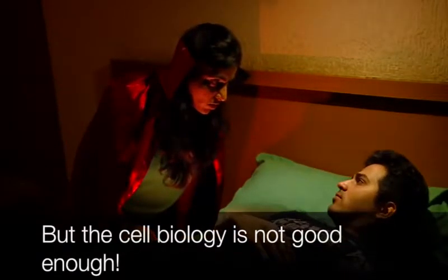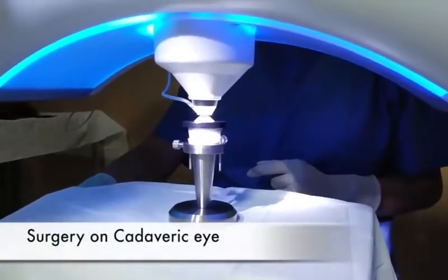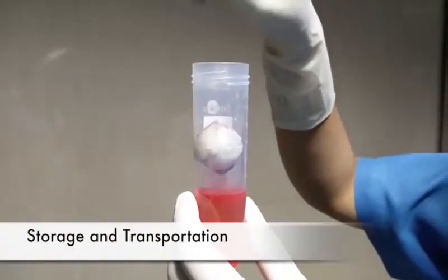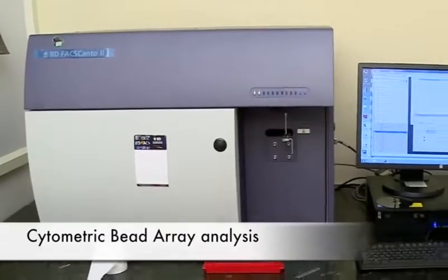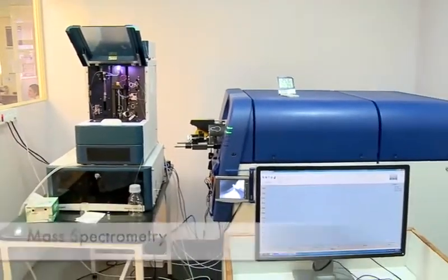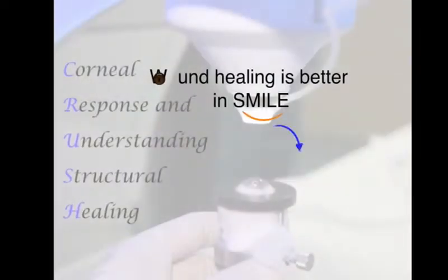The cell biology is not good enough — I am still not convinced. To get a better understanding of the cell biology, we performed LASIK and SMILE on contralateral cadaveric eyes and transported them to our laboratory. After preserving in liquid nitrogen, the samples underwent analysis for inflammation and markers for wound healing. We found that the markers for wound healing were increased in SMILE, indicating better wound healing and rapid stabilization.